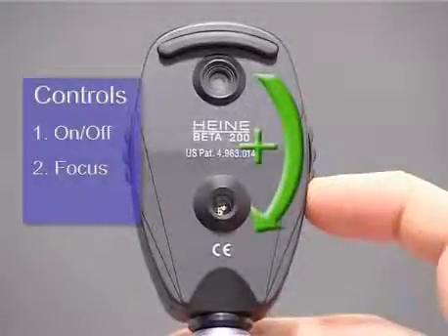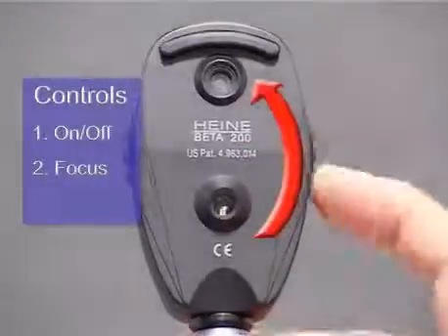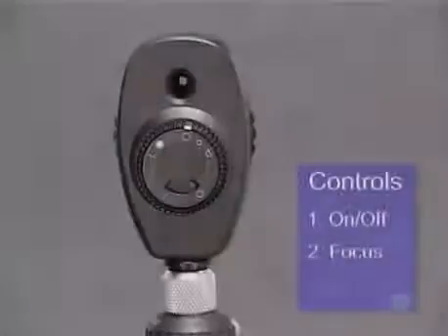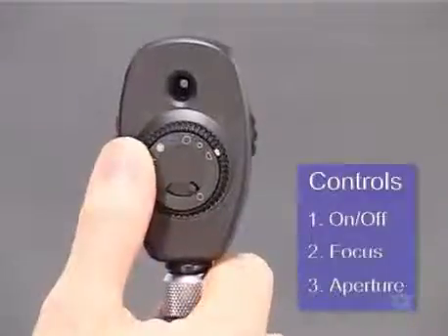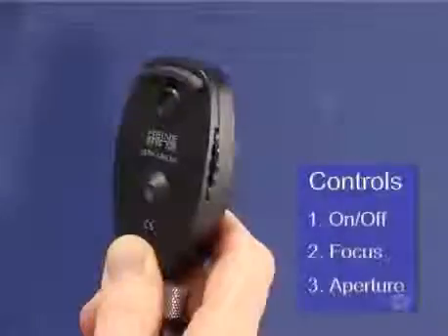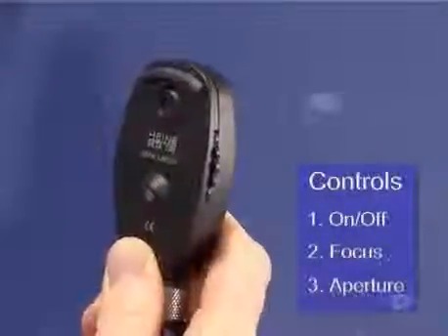Increasing lens power moves the focal point nearer the observer. Conversely, anti-clockwise rotation effectively decreases the power of the intervening lens, which moves the focal point further away from the observer. The third control is for the light aperture. It's usually found on the front of the instrument as a dial or small lever, and it allows you a choice of different shapes and sizes of apertures, usually including slits as well as green or blue filters.